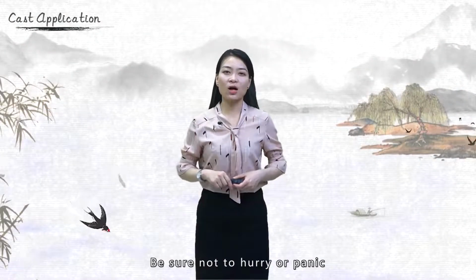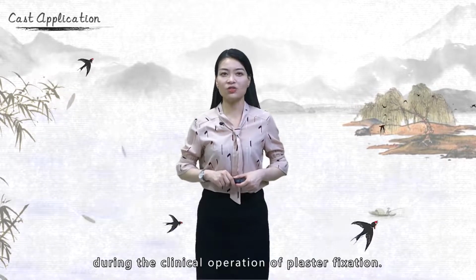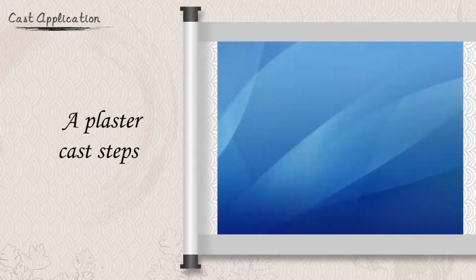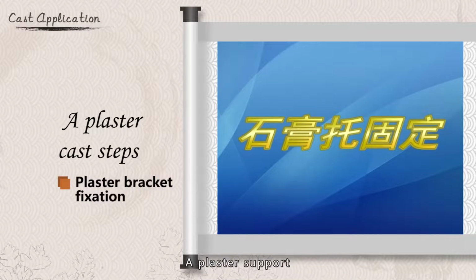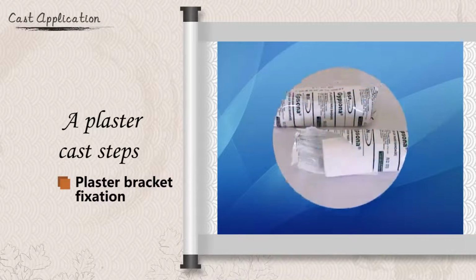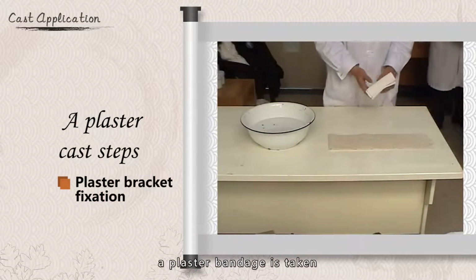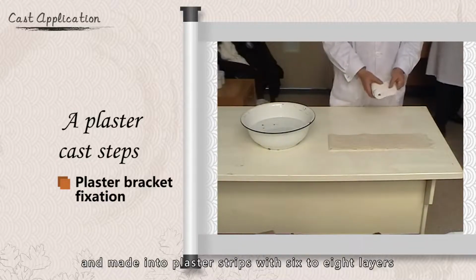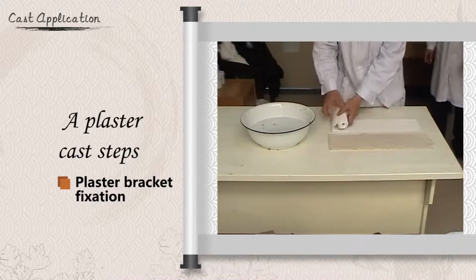Be sure not to hurry or panic during the clinical operation of plaster fixation. Plaster fixation method. The plaster is soaked. A plaster bandage is taken and made into plaster strips with 6 to 8 layers according to the required length.